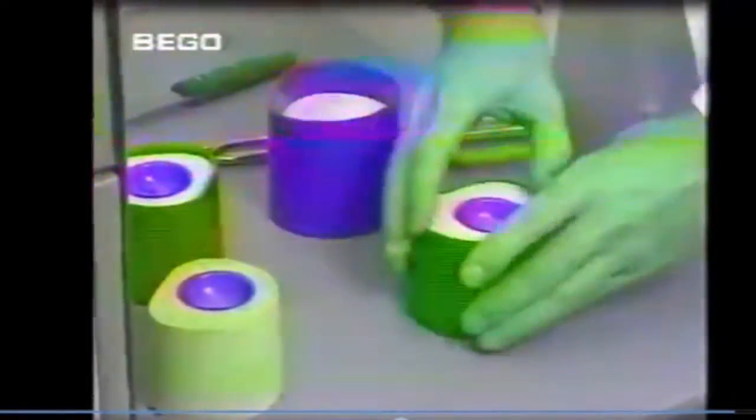The mold former is removed after 10 minutes. The muffles are marked to enable the amount of metal required to be apportioned correctly. After 30 minutes, the investment is fully hardened and the muffle can be placed in the preheating furnace. The muffles may crack during preheating if the investment material is not allowed to set for the time specified.